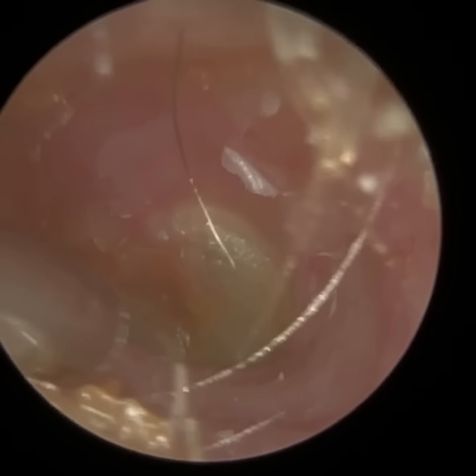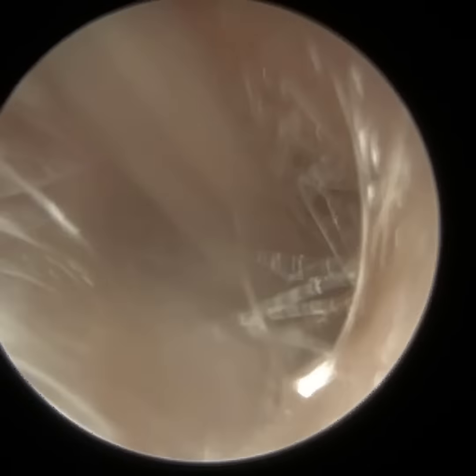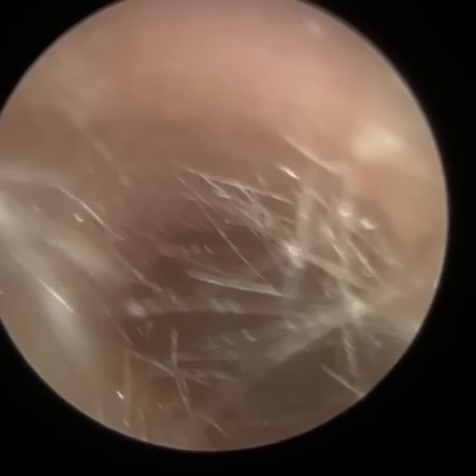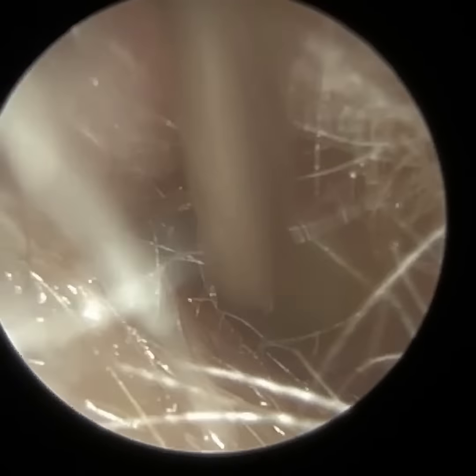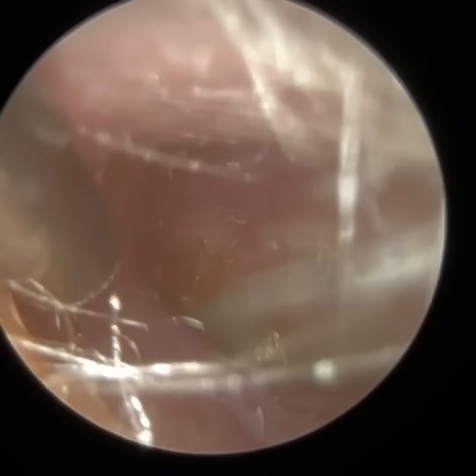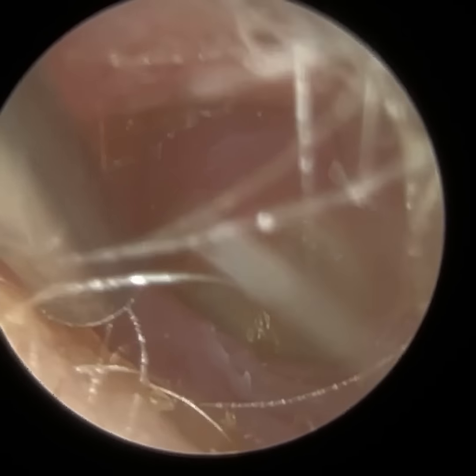You can see the majority of the skin, that dead skin that failed to migrate, has been removed. I'm just mopping up a bit at the entrance. I'm going to try and remove a bit more of the eardrum. I think they experience the caloric effect a bit later. And so this is a chronic problem for the patient.